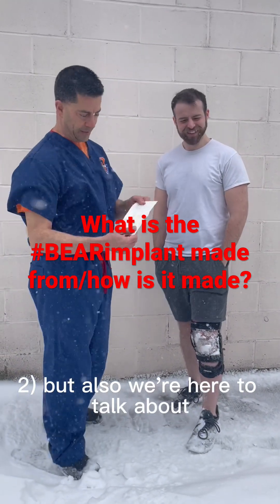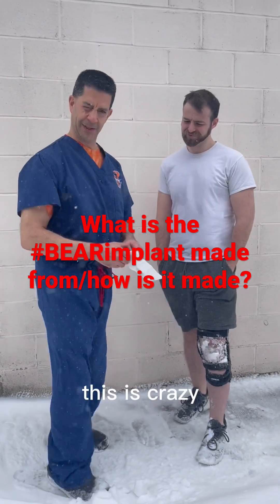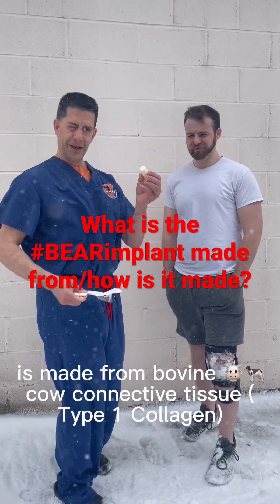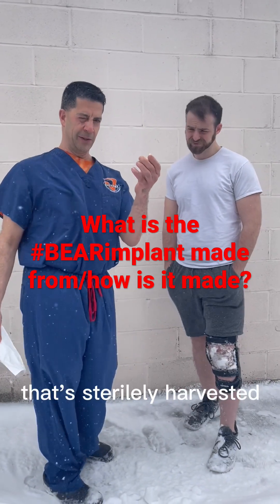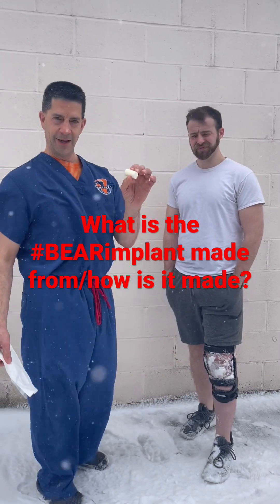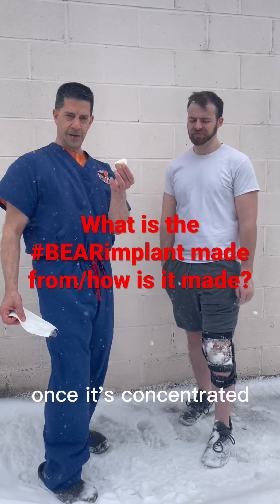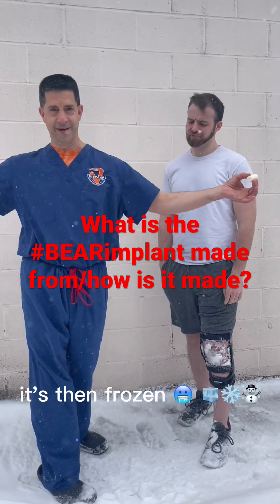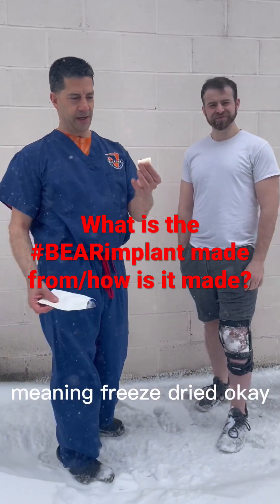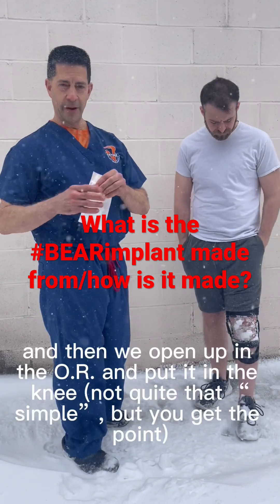But also we're here to talk about the actual BEAR implant and how it's made. Now why are we out in the freezing cold? Because this little implant here is made from bovine, cow connective tissue that's sterilely harvested, and then a connective tissue slurry is made and it's concentrated to 10 milligrams per milliliter. Once it's concentrated, it's then frozen — frozen like we are right now — and lyophilized, meaning freeze-dried. And then it's vacuum sealed and then we open up in the O.R..